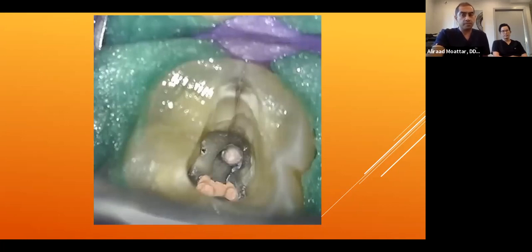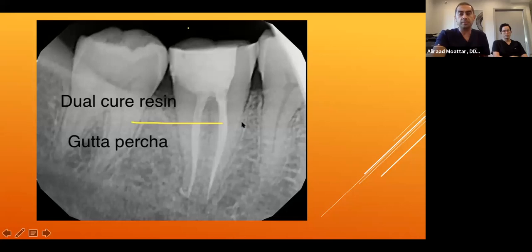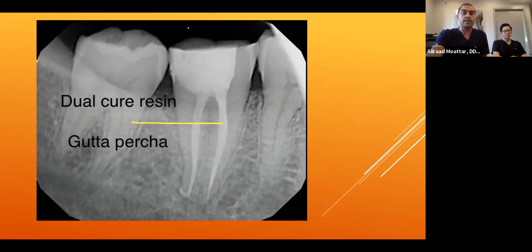Root canal treatment was completed and the tooth restored with resin composite. After obturation, a few millimeters below the fracture line, we inject dual-cure composite and fill the whole canal, the crack, and the access — hoping that with proper full cuspal coverage restoration, the tooth can survive. We also put the tooth completely out of occlusion.